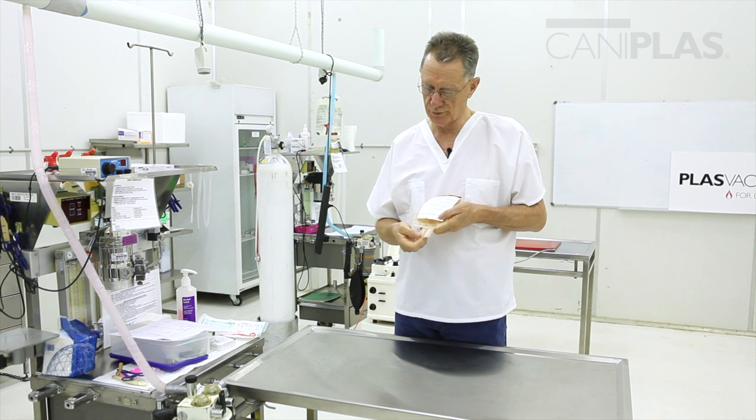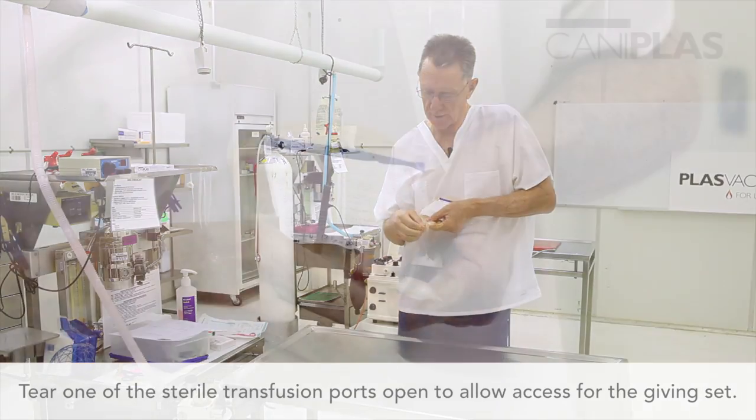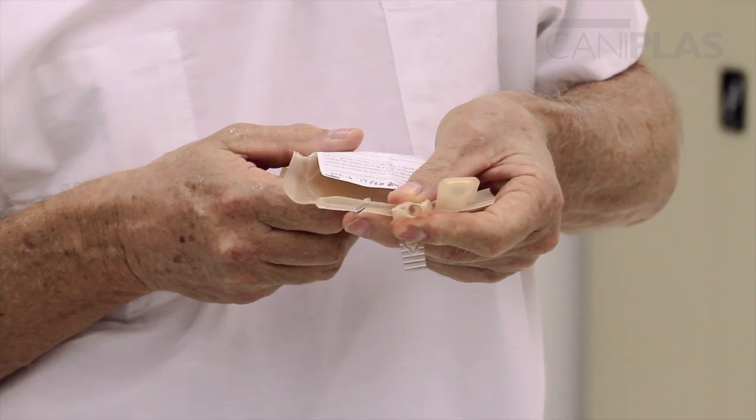Now we have our sterile transfusion ports. I'll tear one of those open, which is going to allow access for the giving set. You can see that's where the giving set spikes into the bag.